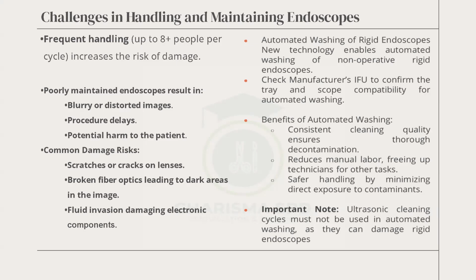Scratches, because the surgeons go in with instruments like flexible graspers to take biopsies, and in the process they can damage the lenses. The semi-rigid ones, the doctors can bend it to see something that is very, very hidden, and in that case they can also damage it. All right, could be broken. And fluid invasion is a common one too. So if you soak it, it can damage it.